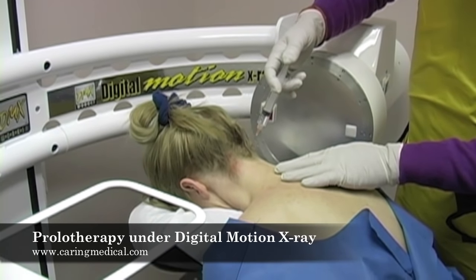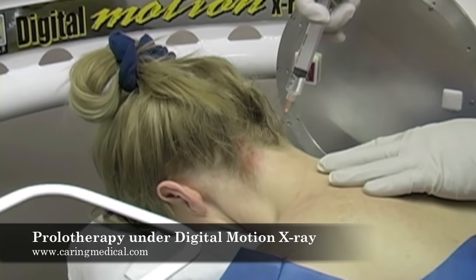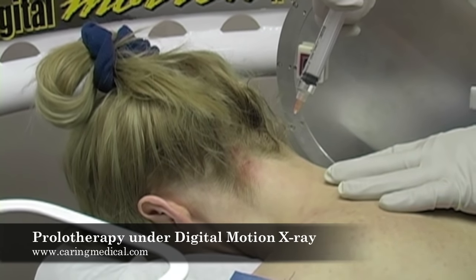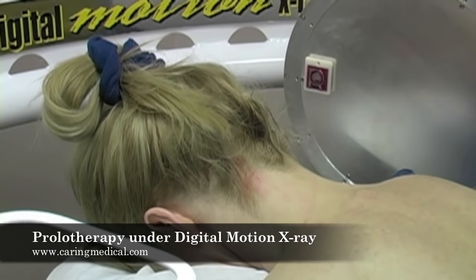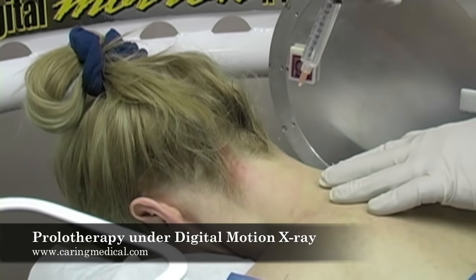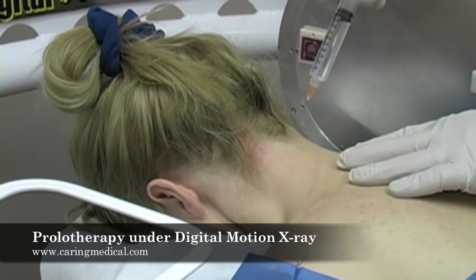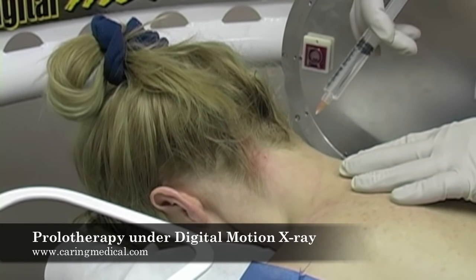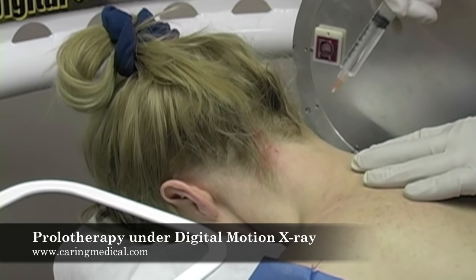Here you see the prolotherapy needle on C1. C1 instability, I think, is a lot more common than people believe it is, and digital motion x-ray is one way to document it. Here I'm finishing up the C1-C2 treatment on this particular patient, and she's had a great response with prolotherapy.